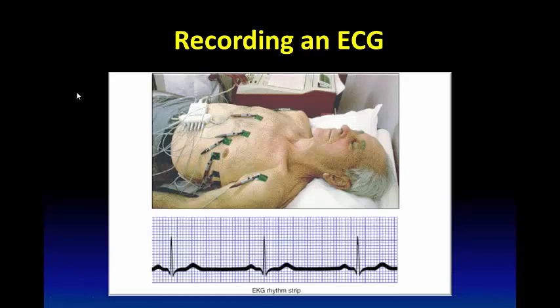So having described the ECG leads, the unipolar ECG leads, and the bipolar ECG leads, and having known that we can have 12 ECG leads, 9 of them are unipolar leads and 3 are bipolar leads, let's see how the ECG is recorded, how these ECG leads are recorded. We can record each ECG lead separately, but this will not be convenient for the patient and it will take a long time to record the ECG.